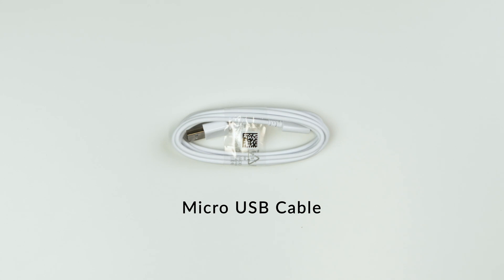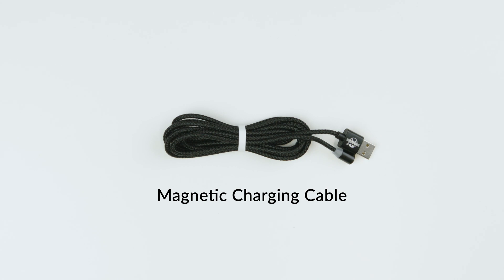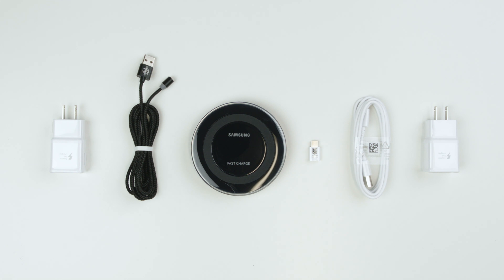Here is the charging pad, here is the micro USB cable, here is the USB Type-C converter, and here is the magnetic charging cable. Our other video, 'Charging Your Iris Vision,' explains how to use each of these items.